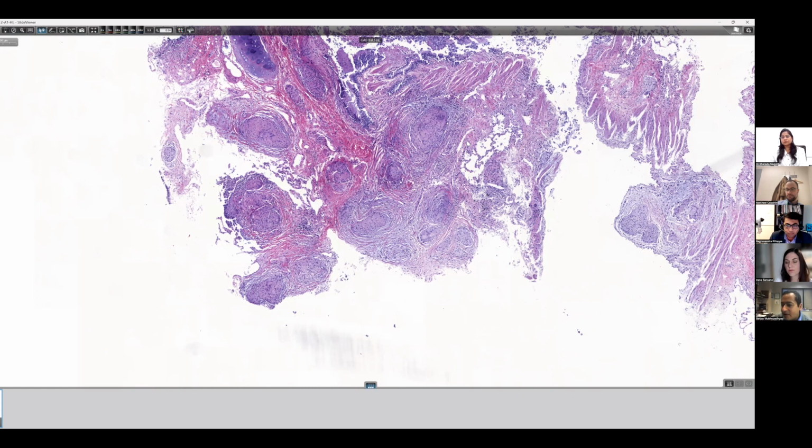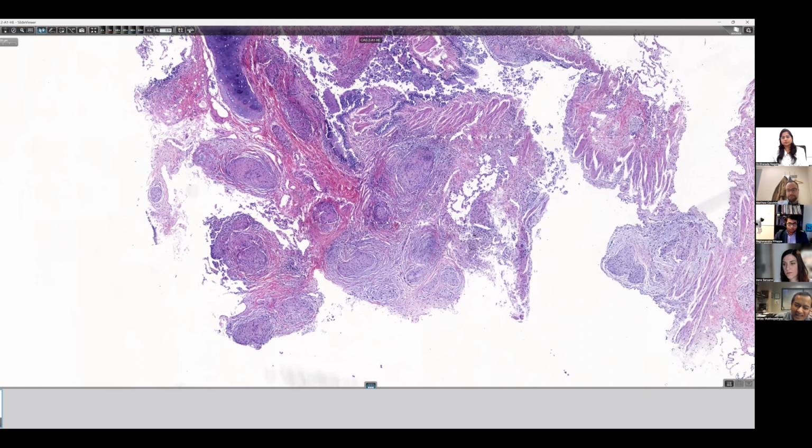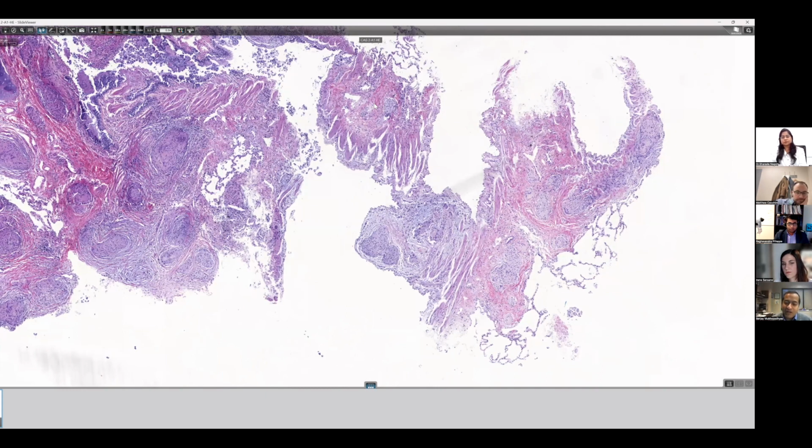Irene, let's say this case, the case you just showed. Let's say you had knowledge that the patient has bilateral hilar mediastinal adenopathy. There's clinical suspicion for sarcoidosis. Even in a cryobiopsy here, I would say non-necrotizing granuloma is consistent with sarcoidosis. I would put that in the line if I knew that. And then let's say you had a surgical biopsy, and you had the perfect thing, everything is perfect for sarcoid: the morphology, the distribution, the hyalinized fibrosis. Even in those cases, I say non-necrotizing granuloma is consistent with sarcoidosis. But if there is any doubt in my mind that it might be something else or that there's something discordant, that's when I back off and I just say non-necrotizing granuloma. So that's my approach. I do put sarcoidosis in the line sometimes if I feel that it's absolutely clear cut, when granulomas are apparent, when they have fibrosis and are distributed along the lymphatics.